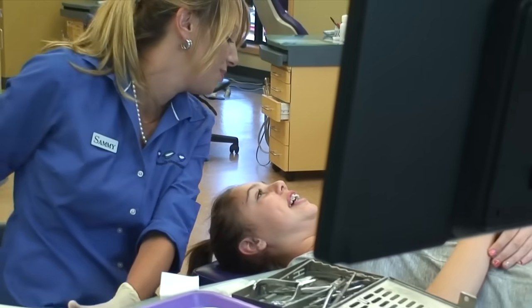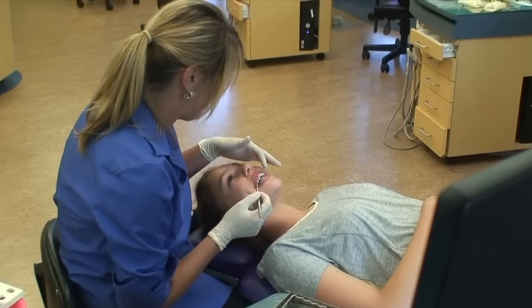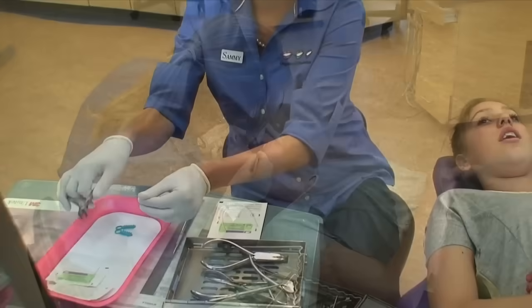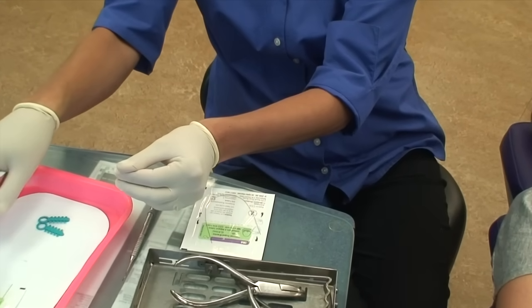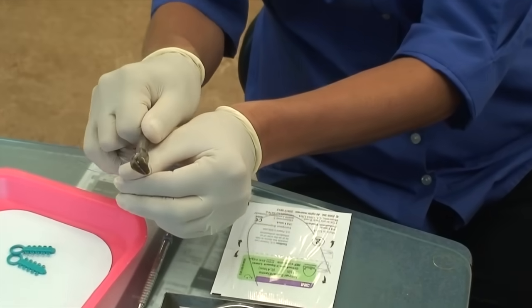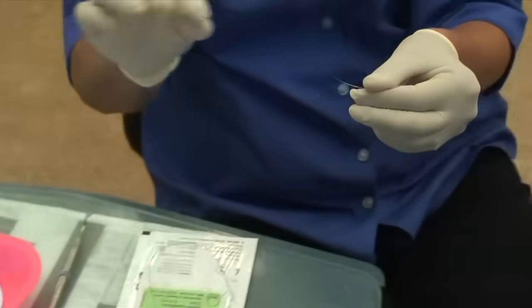we move to the next step, which is putting the wires onto the braces themselves. Okay, at this point, Sarah has all of her braces on. We've used the light to make the glue hard, and now she's ready for the next step, which is to put her wires in.